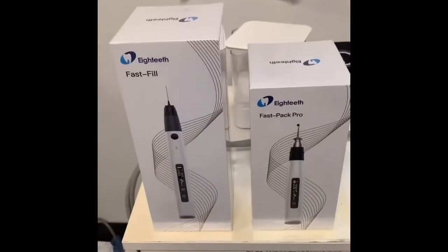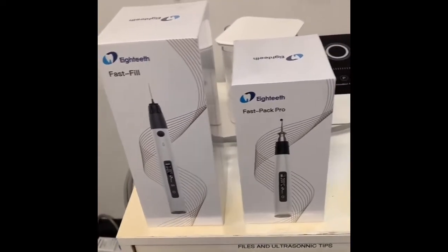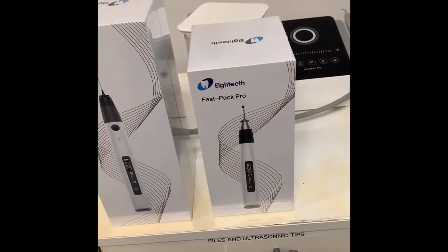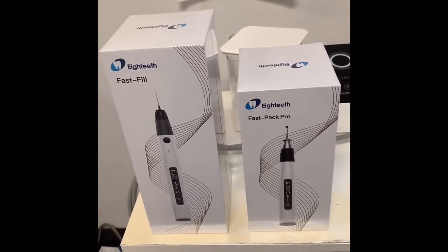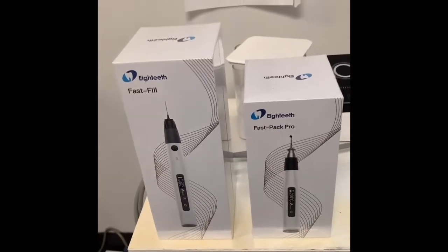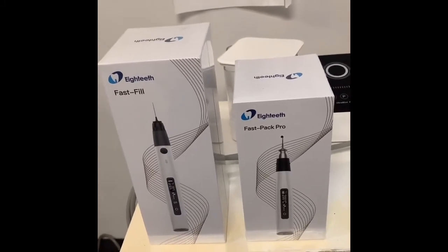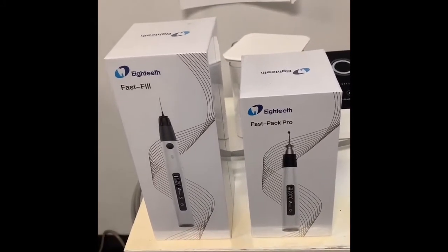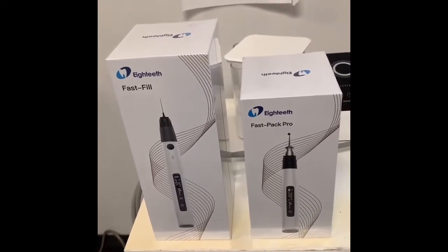A few weeks ago, I received these two units from Eighteeth: Fast Fill and Fast Pack Pro. Unfortunately, I didn't have time to use them. So today, I have a sedation patient, and I'm going to unbox these, use them, and give you my honest opinion about whether I like them or not. Stay tuned — I will be testing these two units.